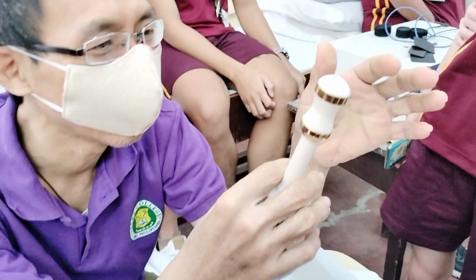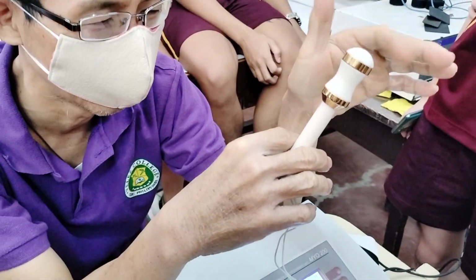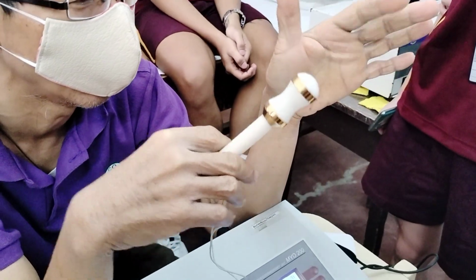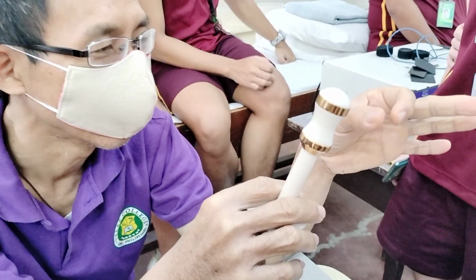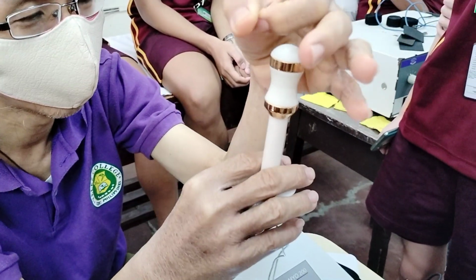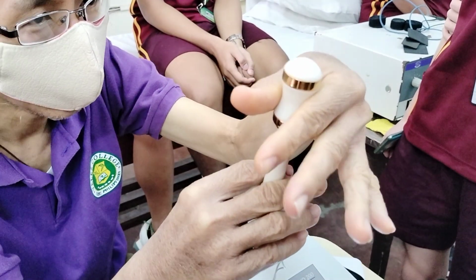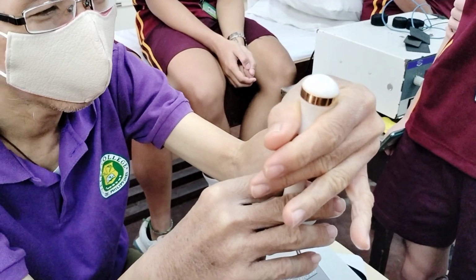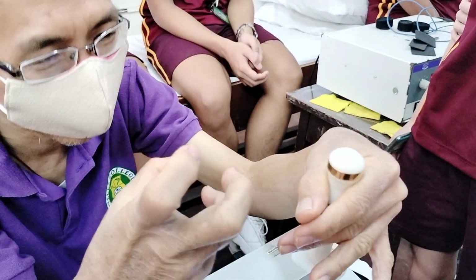Of course, expect that lubricating materials will be placed so the device can slide in. Just imagine it in your mind. Since it goes in the anus, of course, you have to insert it. So you have to tell your patient, ma'am, it's just like you're defecating.